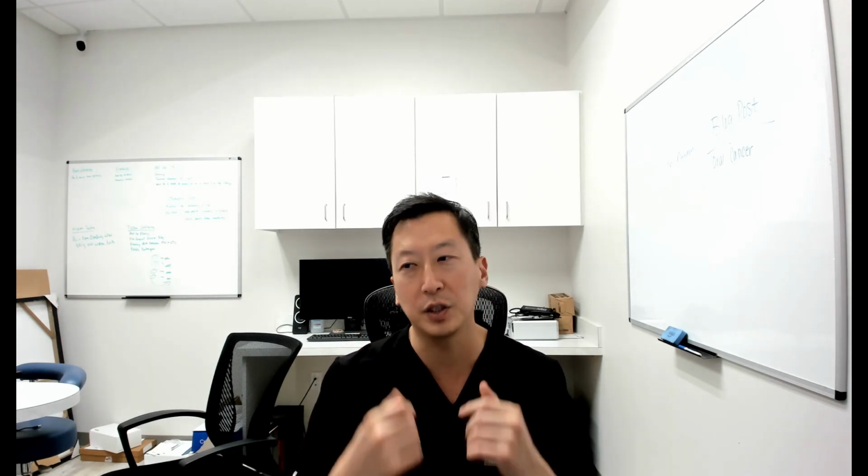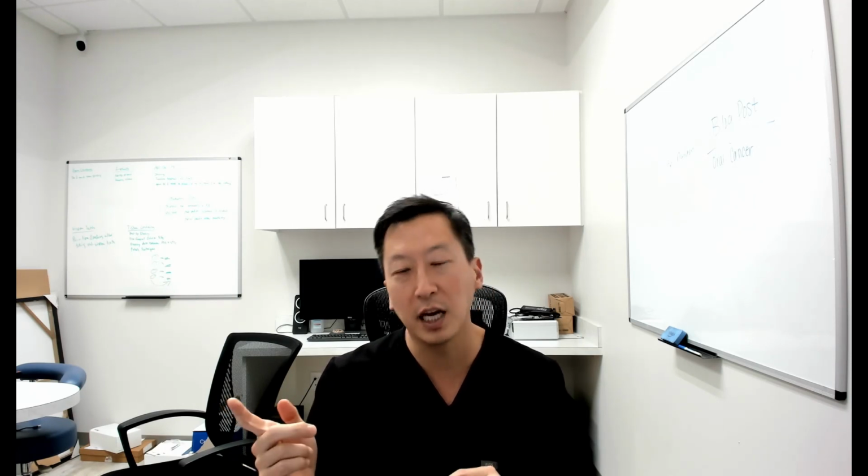We did the digital prosthesis option where, long story short, we actually mill your teeth or we 3D print your teeth. And what that allows your temporary to be is a lot stronger, okay? And then you might be asking, wait, what are we talking about with the temporaries and stuff like that? If you guys haven't seen that video, I have another video talking about how some people want to put you in your final set of teeth within 48 hours, which is an atrocity. Do not do that. Make sure you really watch that video. So I will also link that above.